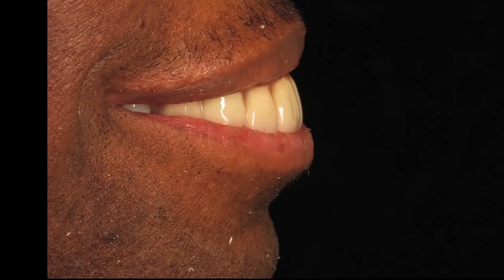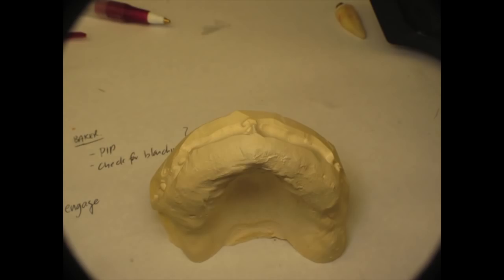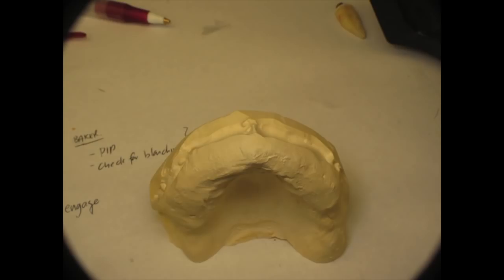The immediate partial denture was based on some cast surgery, just removing some teeth. We are aiming to provide him an aesthetic prosthesis and also attempt to achieve lip closure at rest. He said he didn't have this issue when his teeth were okay, say 20 or 30 years ago. So in an effort to do that, we're going to provide him alveoplasty and a complete denture.